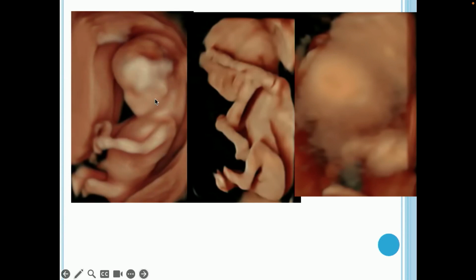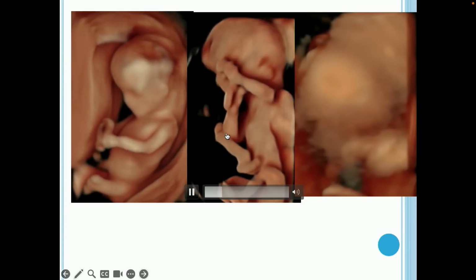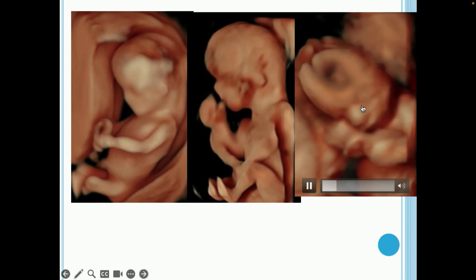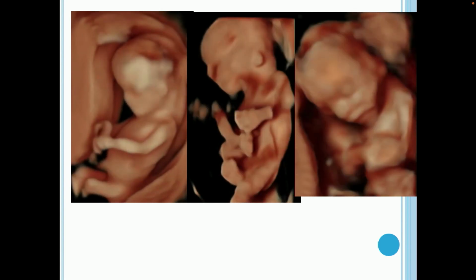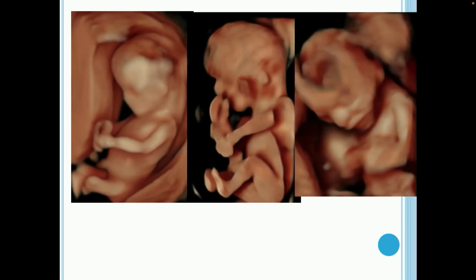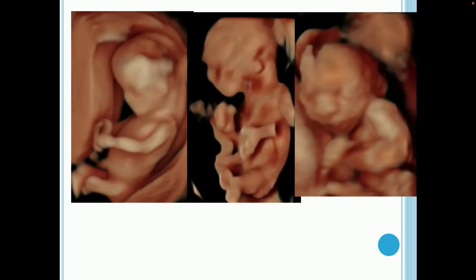And not only that, you can also identify the movements of the fetus, which are very active, and they are very decisive, I would say goal-directed movements, in the sense they decide, I am going to touch the nose, I am going to touch the eye, and I am going to touch the chin, and so on. So they are very definite, goal-directed movements that happen.